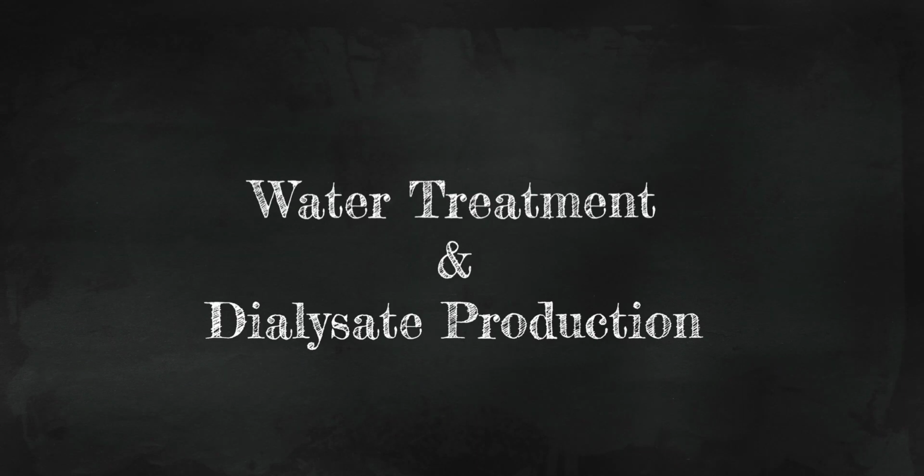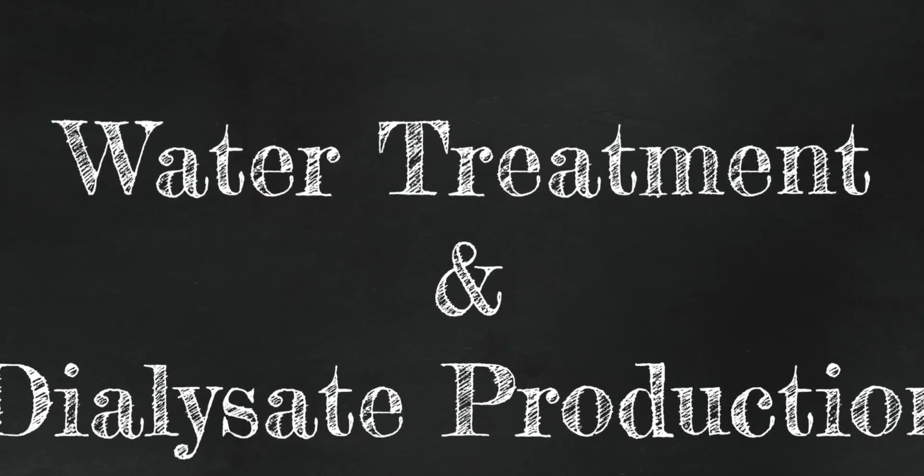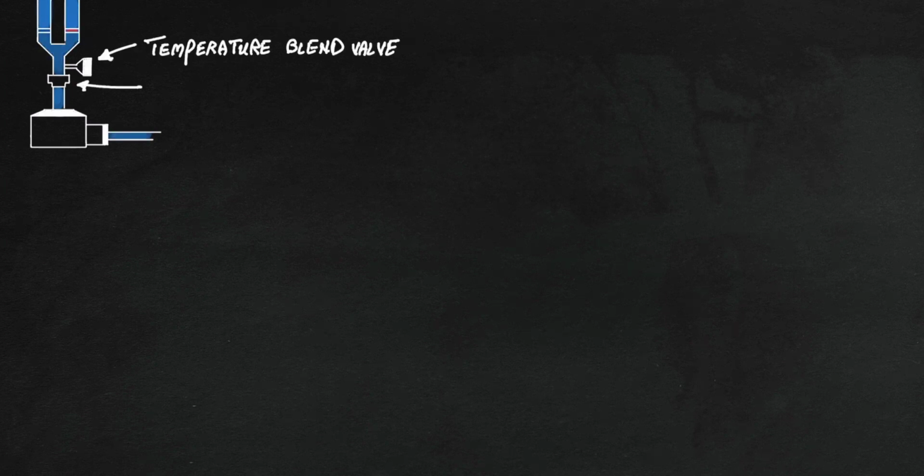Today we'll talk about water treatment and dialysate production. First and foremost, know your source water and seasonal variations that affect your area. This in turn will dictate your particular system components. Your feed water needs to be at the right temperature, pressure, and pH for optimal performance.